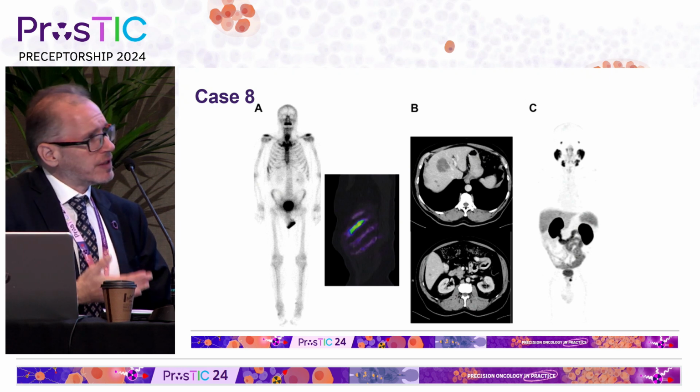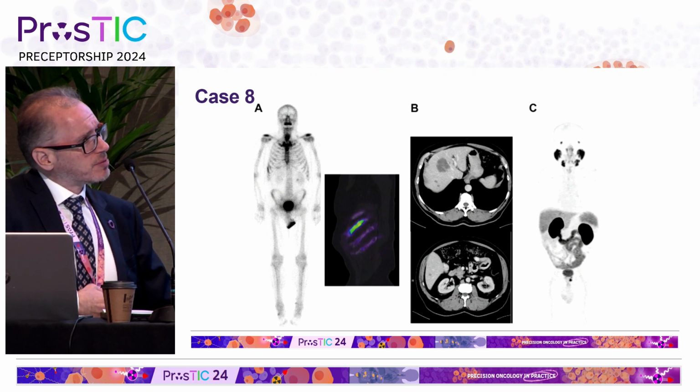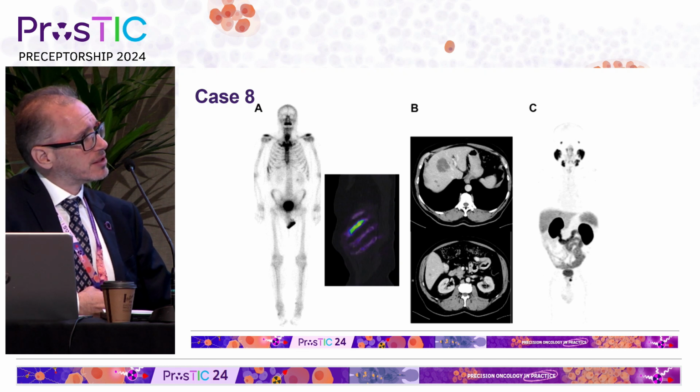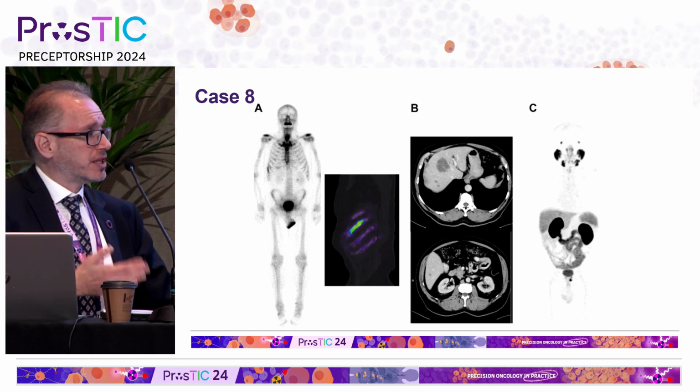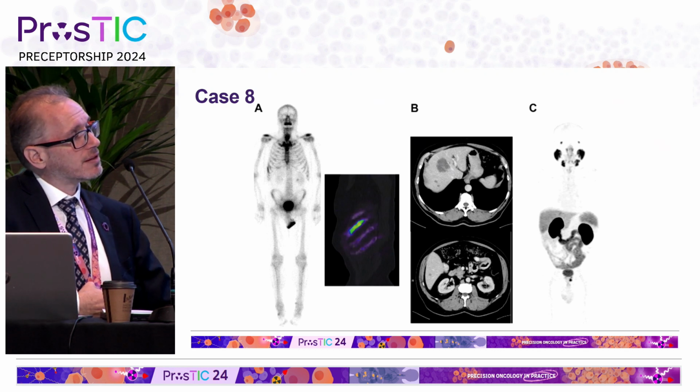And we don't do a lot of FDG early on like we do very late stage, but there's some anecdotal experience in the upfront PSMA trial. Louise, this is a trial where we did PSMA and FDG in a newly diagnosed high volume metastatic de novo population. Do you want to comment on that? Yeah, it was stunning, wasn't it?